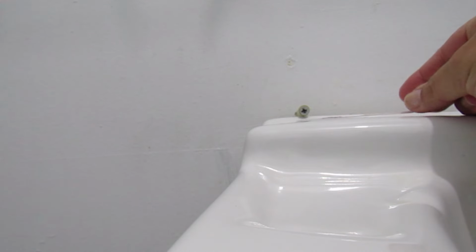Alright, so let's go ahead and get the test opened up. These strips are supposed to be very sensitive, and you just dip them for 5 seconds and you wait 5 minutes and then you read the results. I don't know what they compare to, but they're supposed to be pretty sensitive. I think they detect 10 MIU of HCG. I'm not really sure. I think they're comparable to First Response, if they really are that sensitive. So that's going through. I will let that sit right there. We'll be back in 5 minutes and see what today's says.